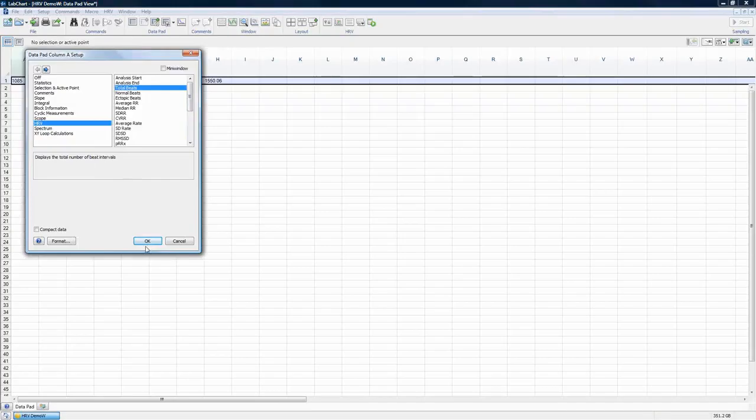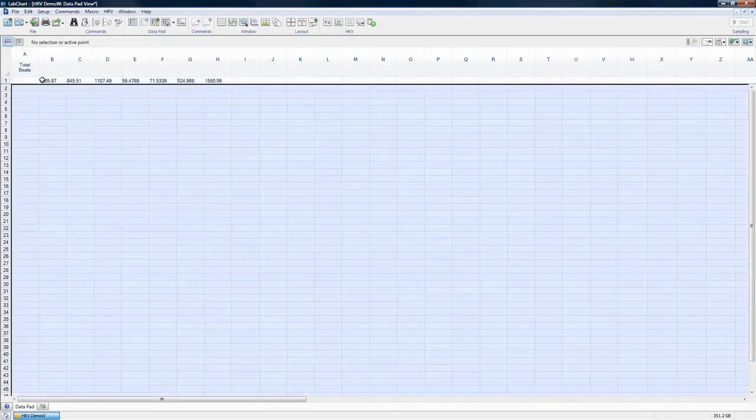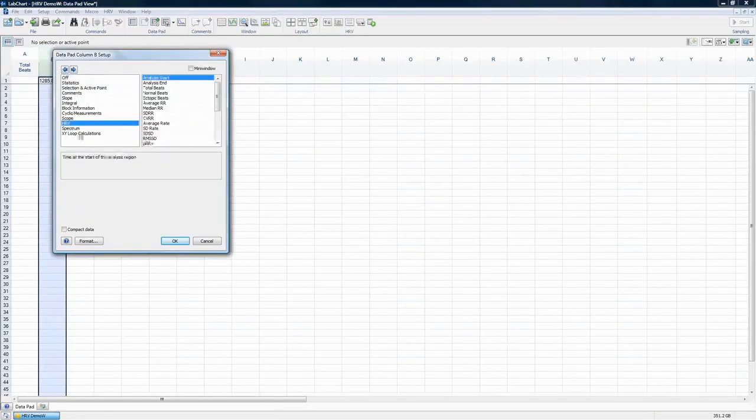Total number of beats. Okay. And of course, every time we click on one, it'll give you a description of what's going on here.